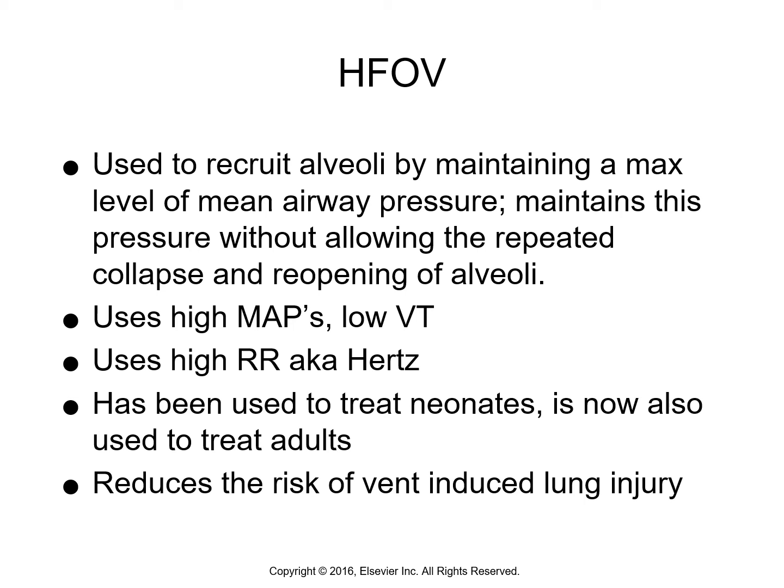So it just maintains that pressure, the same concept as APRV, by keeping that high CPAP or high pressure in there for a prolonged period of time. So it uses high MAPs and low tidal volumes. It uses a high respiratory rate or frequency, which they actually refer to as hertz, and we'll talk about that coming up in a few slides. So it reduces the risk of ventilator-induced lung injury.